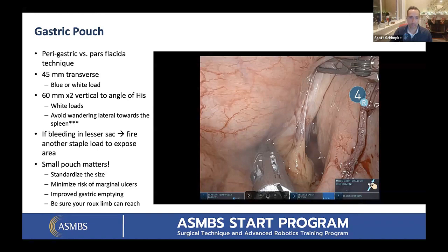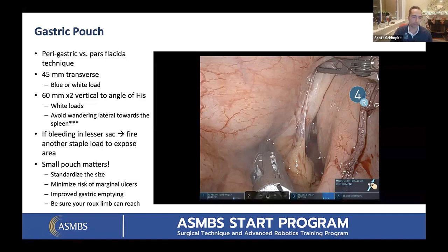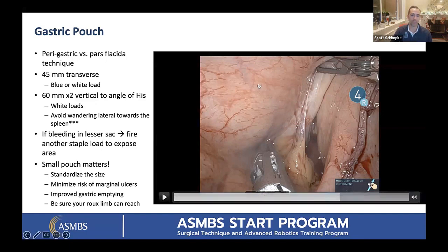Yeah. So I brought up kind of hugging the pouch. And again, I don't use a bougie or a measuring device, but you definitely can. But it's always tempting to go lateral right there. That's where the splenocolic ligament is, and that's where you don't want to go. You really got to commit yourself to go more medial. It does help to have some sort of sizing device that gives you a better idea, but you don't have to. It's always more medial than you think.